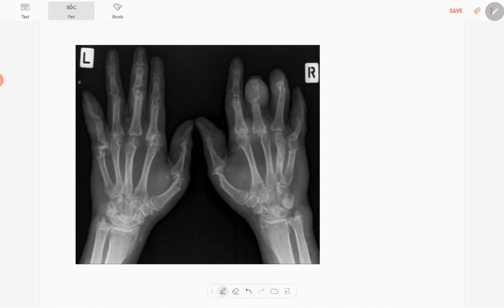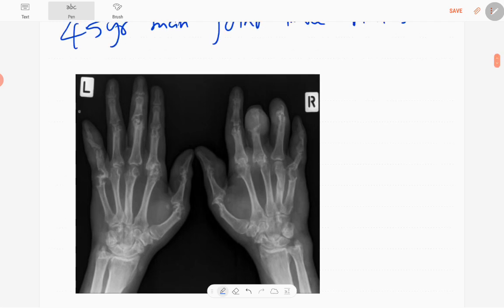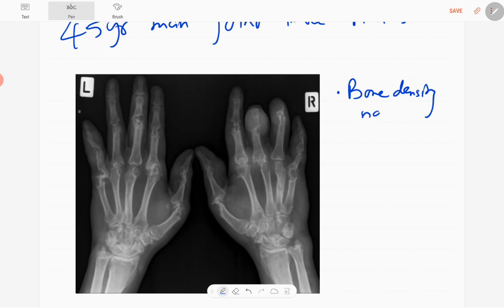In this patient you can see multiple abnormalities in the joints. Bone density is normal and the trabecular pattern is also normal.